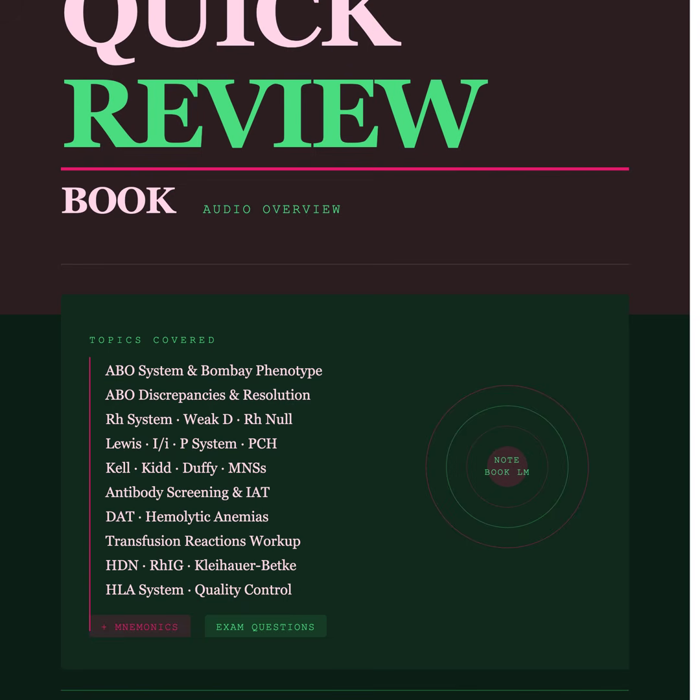But human IgG antibodies are slow to bind in a simple saline suspension. To make the test efficient enough for a fast-paced hospital, we rely on enhancement media to manipulate the thermodynamic and electrical environment of the test tube to force the antibodies onto the antigens faster. The study guide provides an excellent comparison of our chemical toolkit. Let's break down the physical mechanisms of each tool.